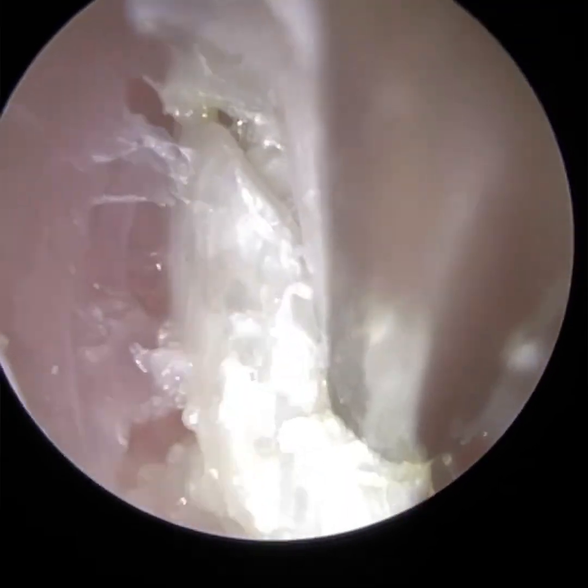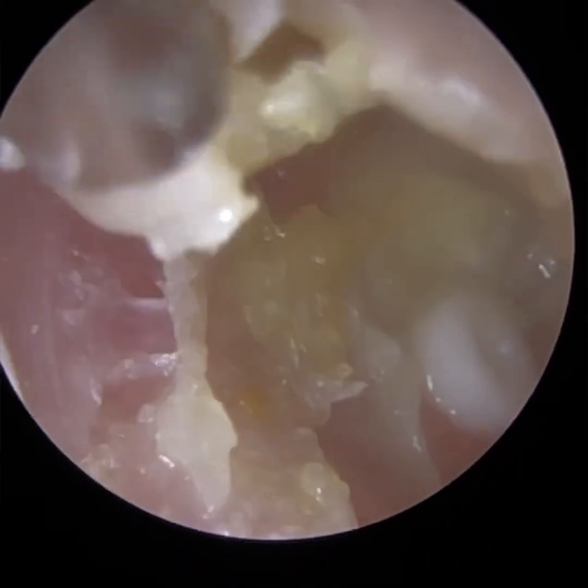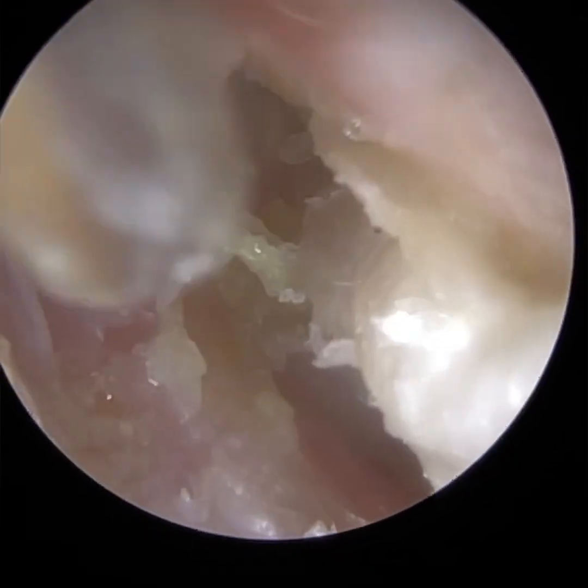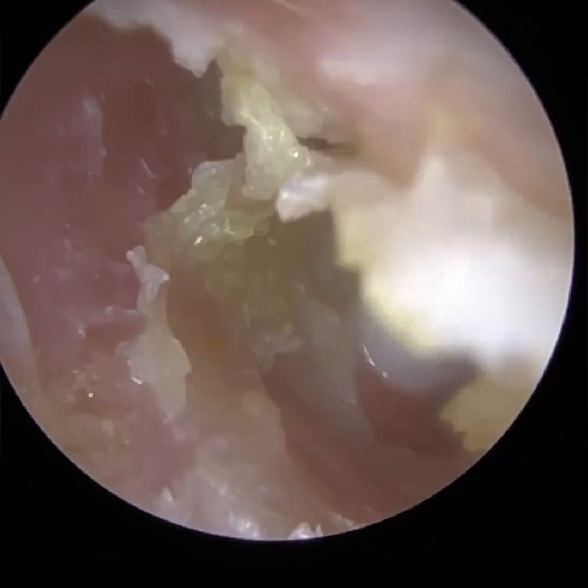It's not infected, but then if it doesn't resolve, it can become infected and purulent, a bit like what this discharge is. So almost twice a year this patient's eustachian tube gets blocked, and they've previously had a grommet. Now, what does a grommet do?